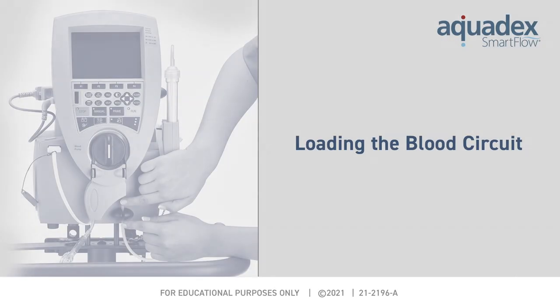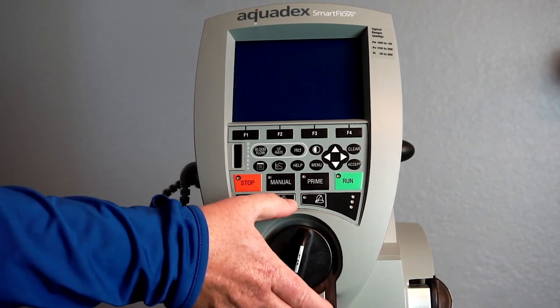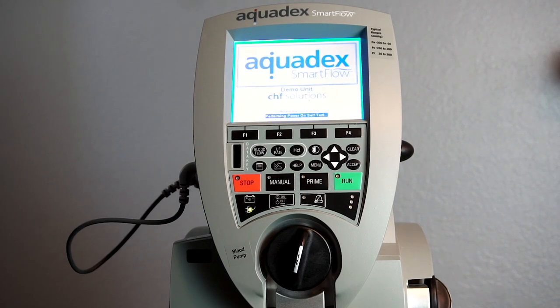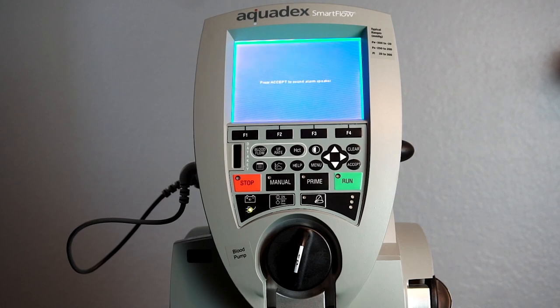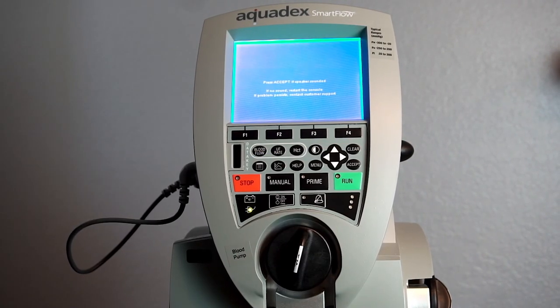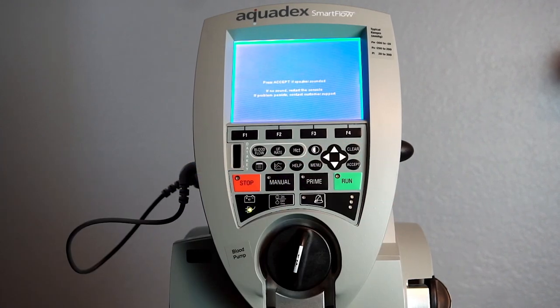Loading the blood circuit of the Aquadex SmartFlow. Start by turning the system on by pressing the on-off button at the bottom of the interface panel. The system will prompt the user to sound the speaker alarm in order to determine that it's working properly. Press accept to sound the speaker, then press accept again. You will then arrive at the home screen.